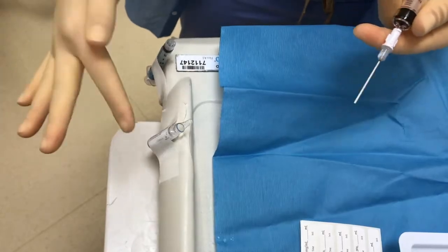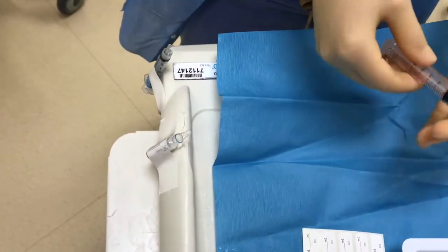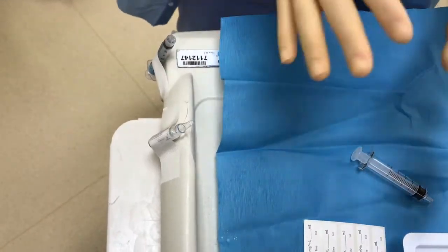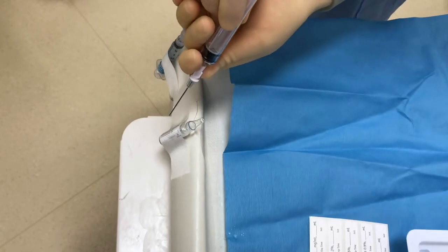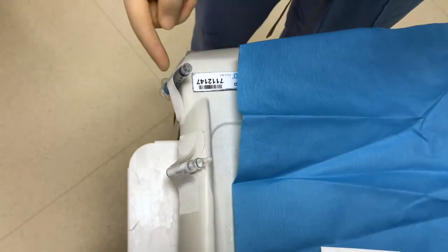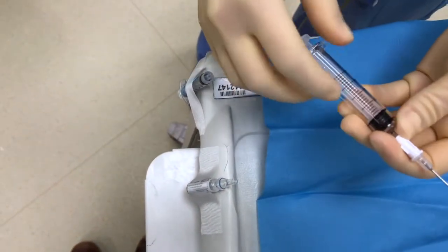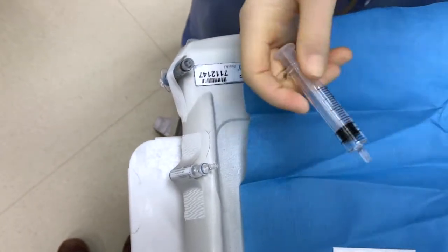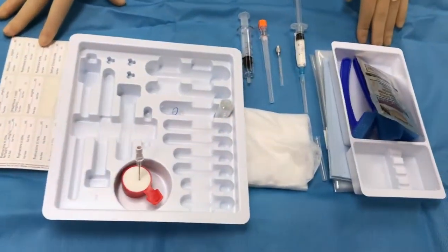Okay. And then, again, for the spinal, this is typically 0.75%. The spinal dose is variable depending on the procedure and the attending. It can be anywhere from 1.2 to 1.6. You would draw up whatever amount of bupivacaine is required for this procedure. And then almost always 20 mics of fentanyl is what you would draw up, which on this syringe is going to be 2 clicks. So we will have drawn up our spinal dose, and now we have this kit set up.